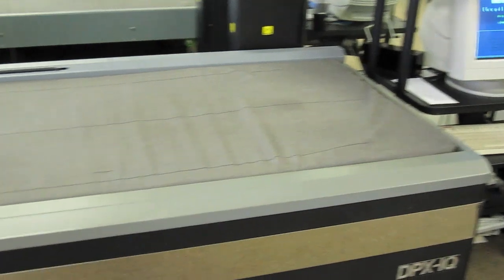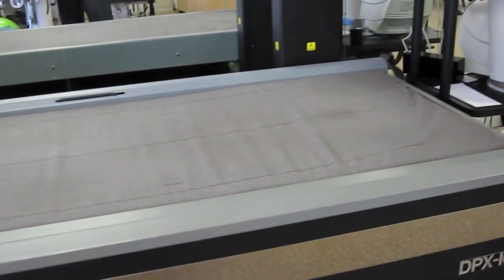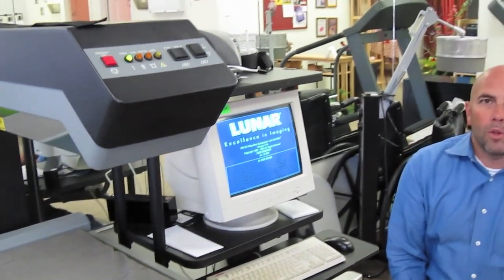Another nice thing about this piece of equipment is it also measures your muscle mass. It comes in handy if a person is going through a weight loss program — you can see where you were before, go through your program, and then do another scan to show how productive you were with your weight loss program.